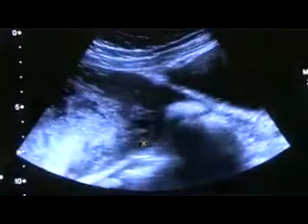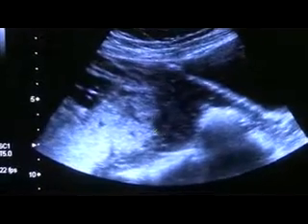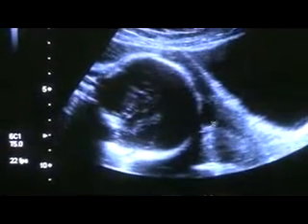This is the placenta, much above. This is the end of the placenta where it is ending. Here we see the internal os. This is the edge of the placenta, and this is the cervix. The internal os is here. This is the head of the fetus.